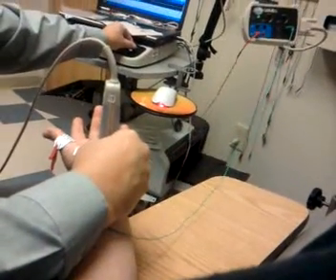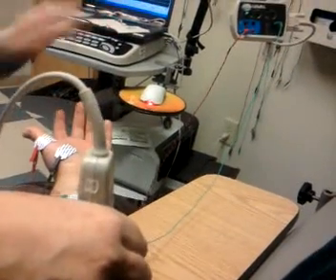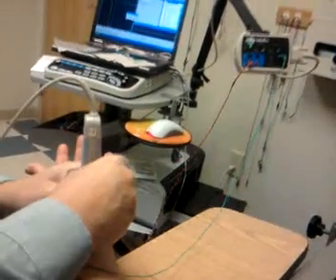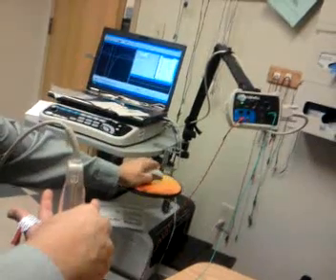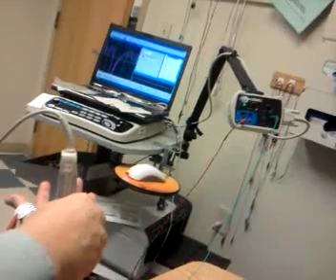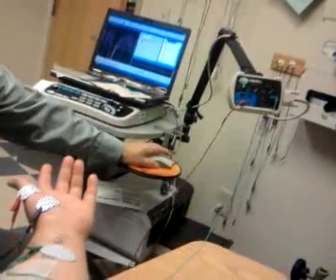Once again. I'll keep that. And another one. So that completes that note. Now we'll go on to the next one.